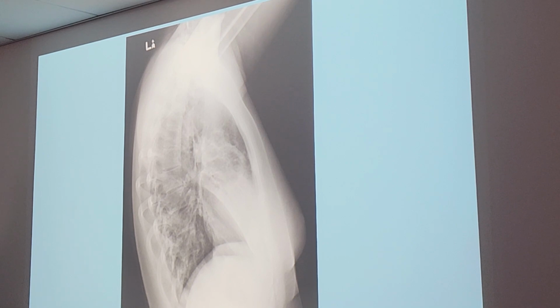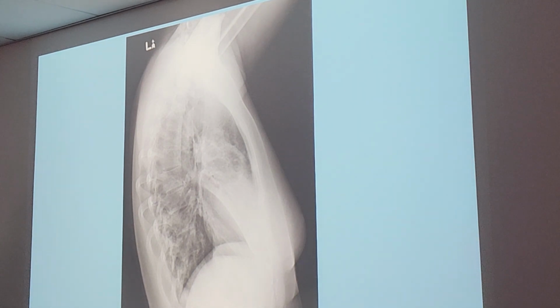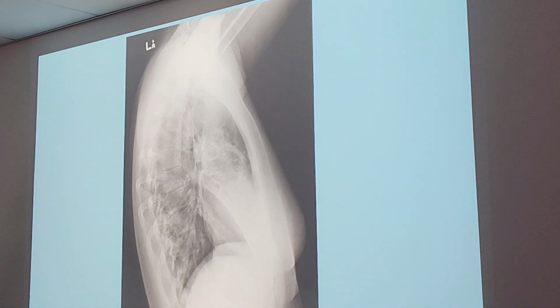Some blur. Okay, rotation, explain to me how you know that. The spine is longer, bigger than a fingernail. Okay, good. The blur. Where do you see the blur? It's fuzzy over here, the right edge. Okay. I think that's it. Okay, what else can we say about this image?